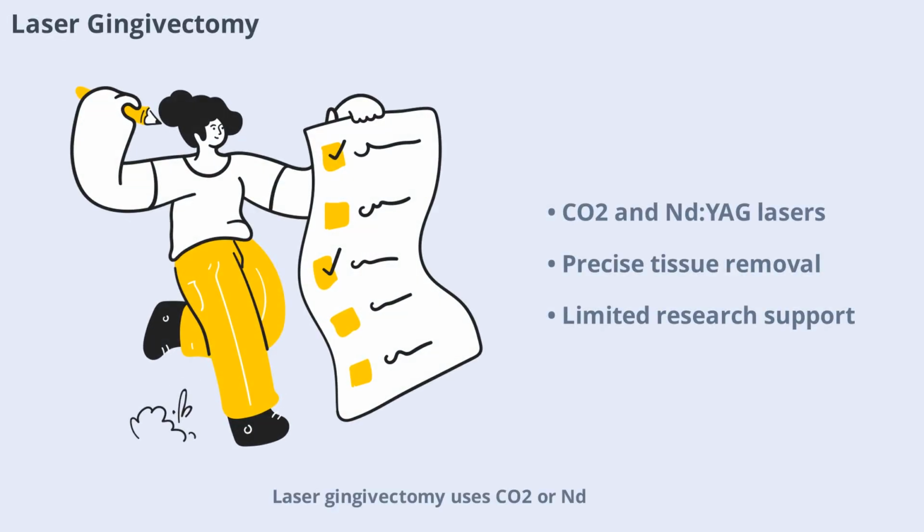Laser gingivectomy uses CO2 or YAG lasers to excise overgrown gingival tissue. While lasers offer precision and reduced bleeding, their use in periodontal surgery is not widely supported by research. More studies are needed to establish their long-term safety and effectiveness in this context.